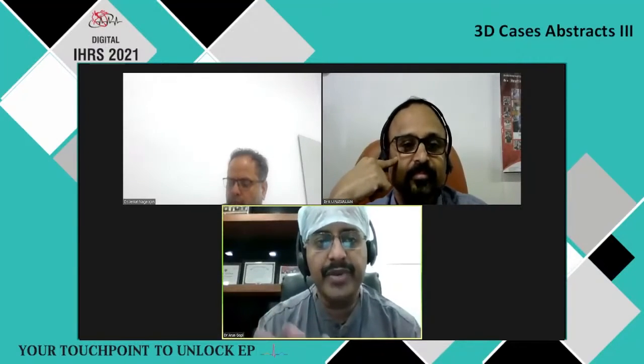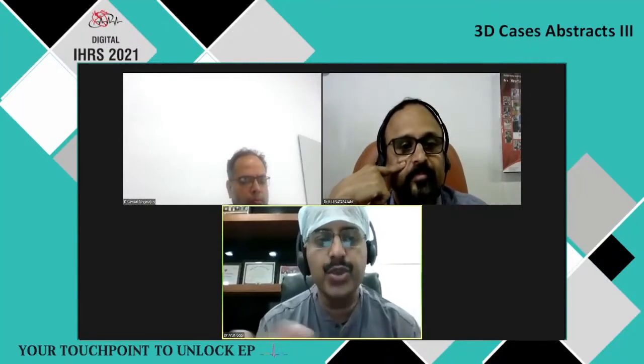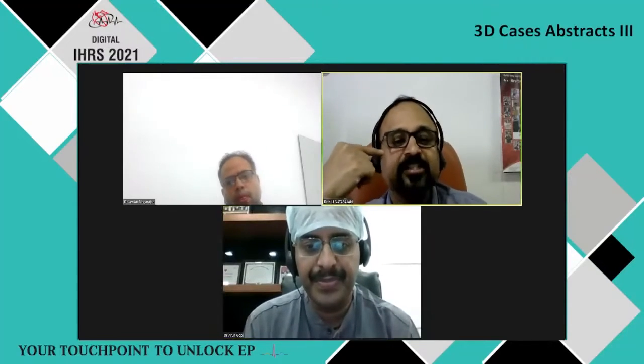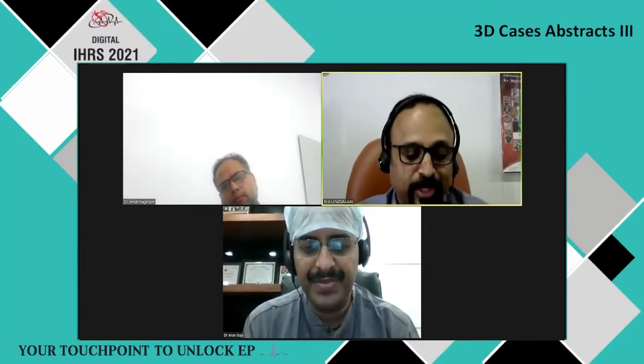With the grid, we are comfortable. We are pushing in and ensuring good contact in all spaces. When the grid flexes, we know you are in good contact, and that gives us the true signals in two orthogonal planes. In that way, grid was useful for us, sir. That is a nice demonstration of the bipolar not having signals, but you ablated in a place where the conventional signal was not there, right? In that first case. Sir.